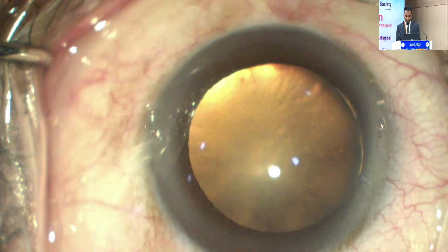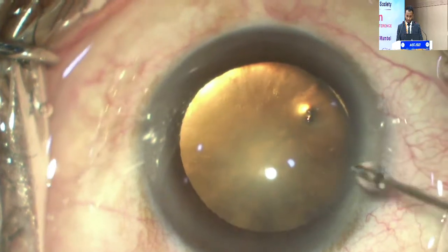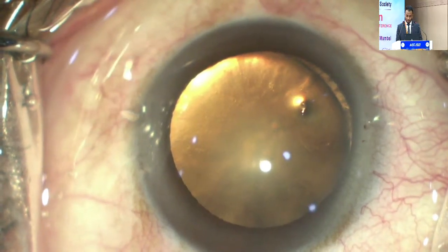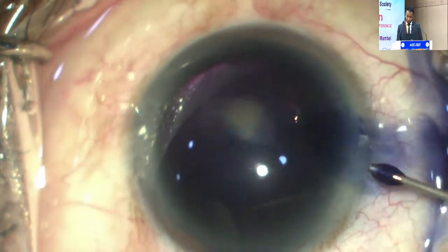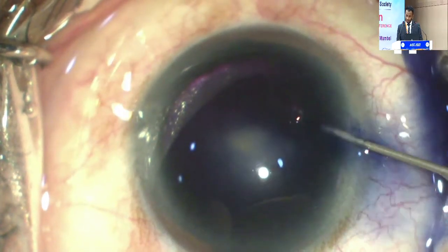So if you can see, subtly there is a zonular dialysis of around 3 clock hours. I put intracameral adrenaline, which reveals a little more than what I had expected, because on slit lamp it wasn't dilating. Trypan blue is an important step, as I said. What happens is I've put a trypan blue. In this case, I am not showing it, but what I do now is, wherever the area of zonular dialysis is, I put a cohesive viscoelastic so that the trypan blue doesn't go behind.